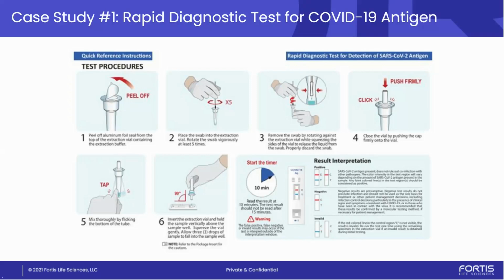Those are very low cost, depending on where you're going and what kind of retention your swab has. So again, low cost.